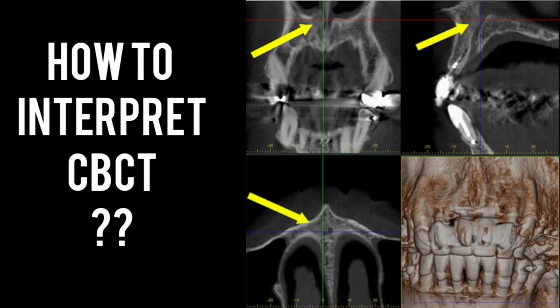A stack of 360 images or exposures is compiled into a volumetric dataset through a computer process known as primary reconstruction. This data volume is then converted into a patient study by accompanying software. It can be visualized as 2D, transaxial, multiplanar reformatted, and 3D techniques such as surface reconstruction and volume rendering.